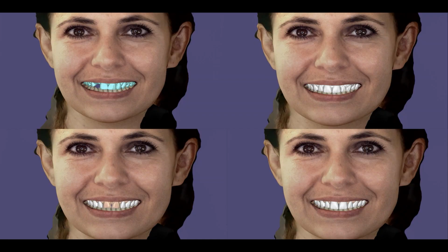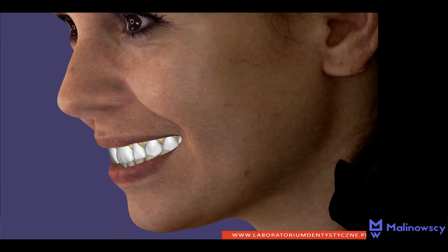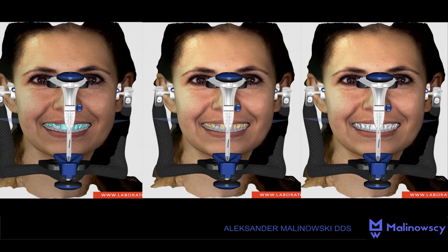Okay, here we see the facial view with the mock-up applied. Please take a look at the design overlaid on the facial scan from the front and the profile view. Here we can see the profile view. As I said before, in the work presented, a digital articulator has been utilized.